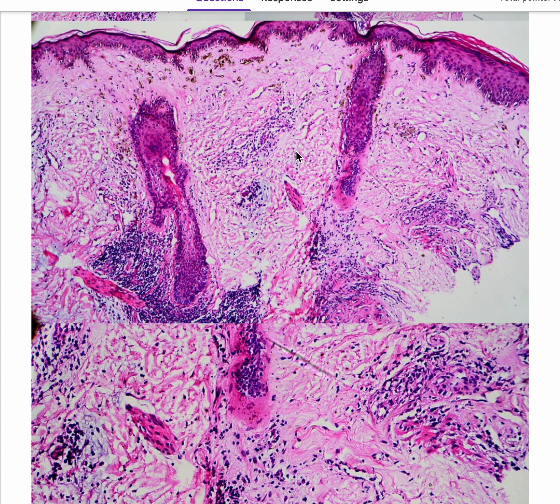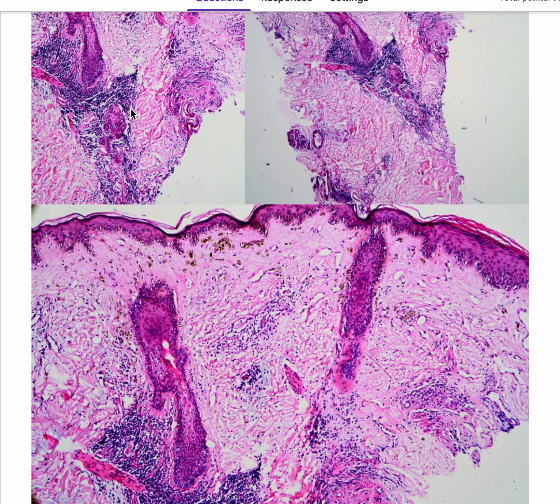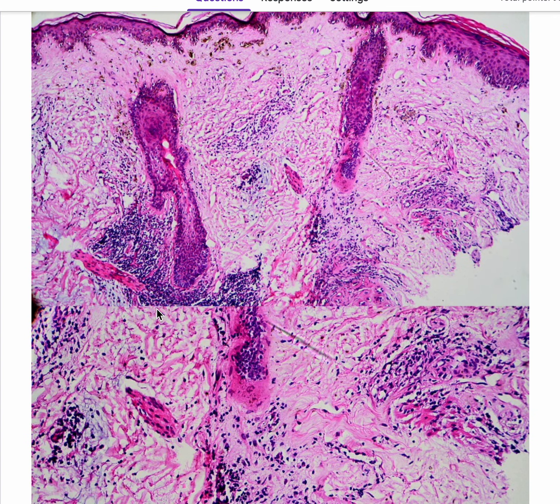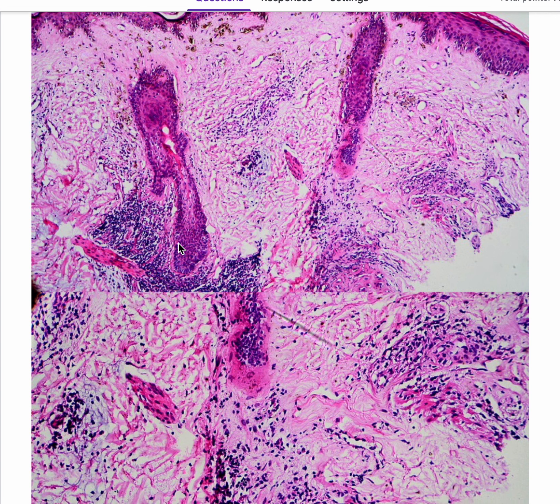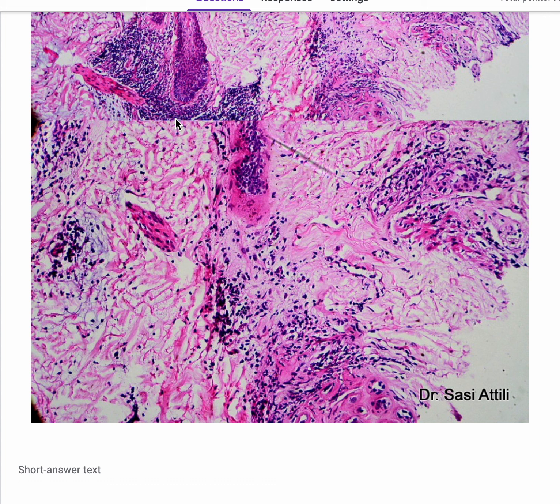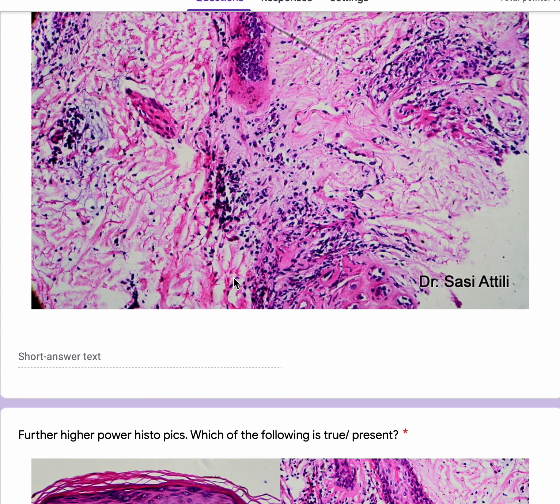There is basket weave hyperkeratosis. There's no parakeratosis, just basket weave type orthokeratosis. The epidermis now is in the post-inflammatory phase. The inflammation is much deeper, and hence the induration. You're seeing the inflammation quite deep down, and because of the dermal scarring, clinically we were able to palpate the plaque. You can see here that the arrector pili muscle is destroyed. It's no longer attaching itself to the hair follicle. This is the arrector pili muscle again, and you can see a perifollicular lymphocytic infiltrate here.